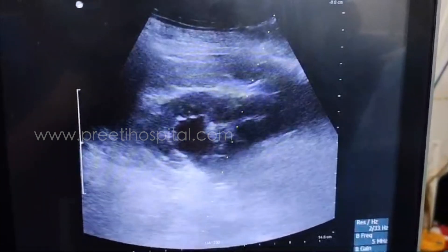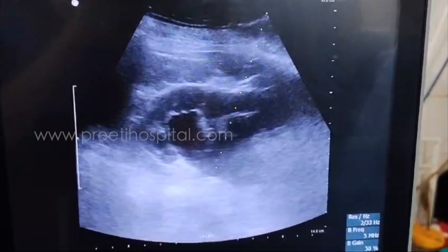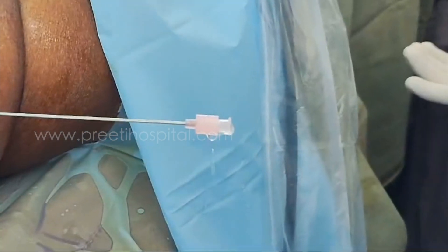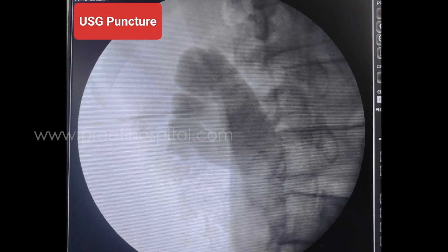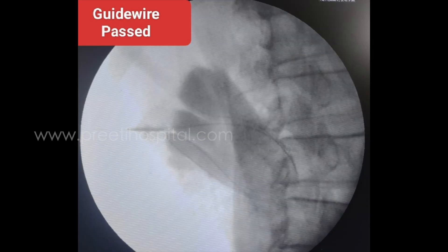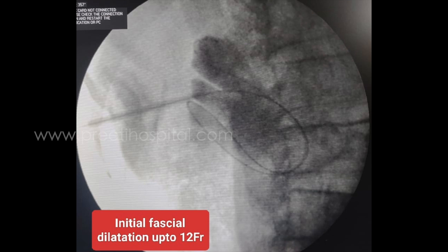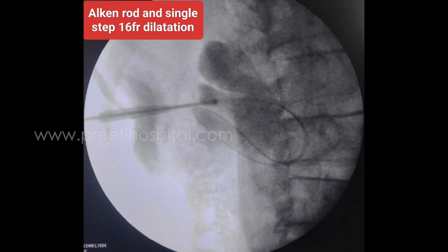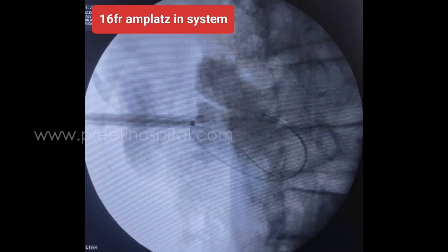Clear urine was draining through the needle. Contrast was injected and confirmed that we were in the upper calyx. A guide wire was passed; initially fascial dilators were used up to 12 French, followed by an Alken rod and a single-step dilation up to 16 French.